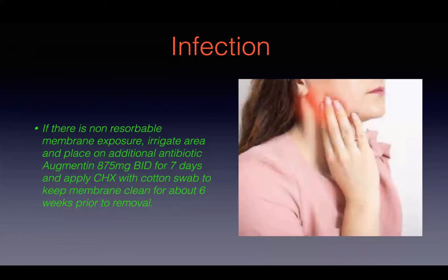That was a post-op back in July. And everything looked great. There was no opening, soft tissue was closed. He did present with a couple of small allograft particulates that were superficial though, as you can see here with that small amount of bleeding. Doesn't make for a perfect picture, but it was all closed. I removed it, didn't have to anesthetize them. So we're going to let that just heal a little bit longer.